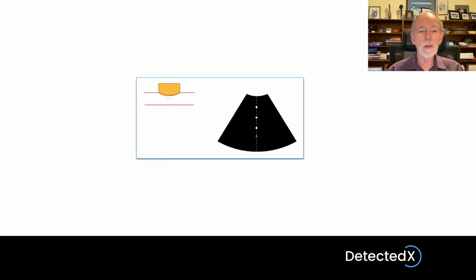So here we have an example where the ultrasound is reflecting between the probe face and a tissue interface multiple times. Each time an echo comes back to the face of the probe, another echo is registered by the probe and displayed in the image. You can see, of course, that since the ultrasound is following the same path repeatedly, these images of that tissue interface will be equally spaced. And so we'll see the tissue interface in its correct location and then repeated at equal spacings over and over again, running deeper and deeper into the tissues.